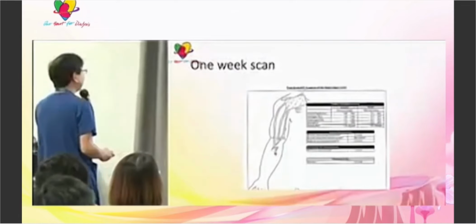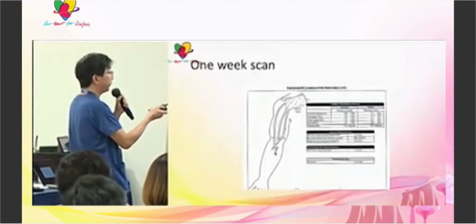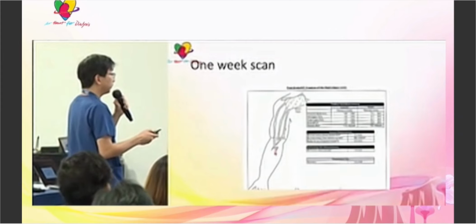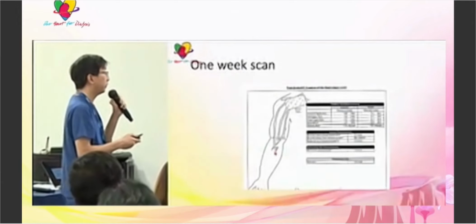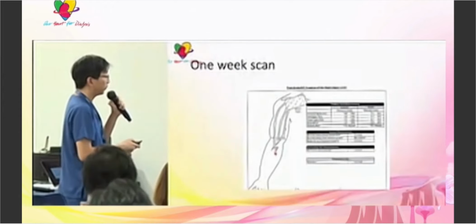This was the 1 week scan. So at 1 week, you can see the brachial artery flow is 382. Sorry, the numbers are kind of small. Perforator 2.8, diameter of the anastomosis 2.5 is still okay. The outflows in the cephalic and basilic are not the best. The basilic is only 285, the cephalic is 173, but we thought we would watch for a while.